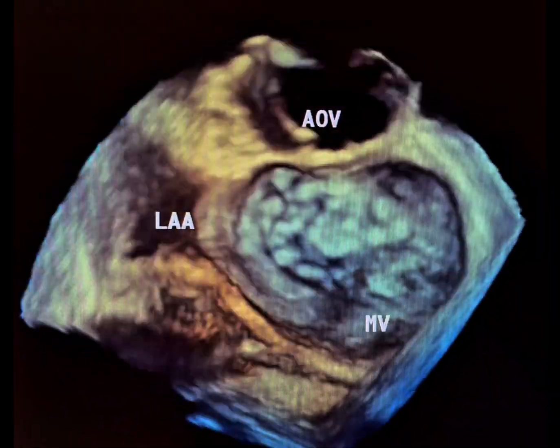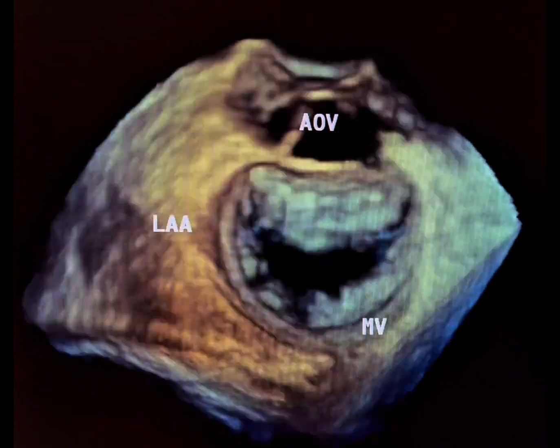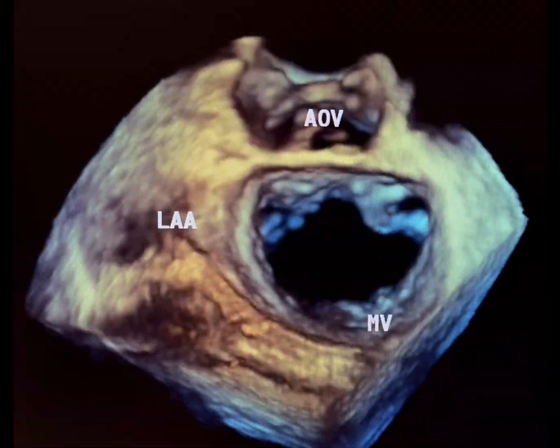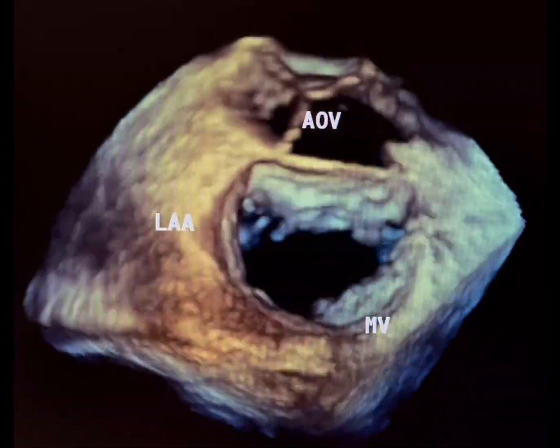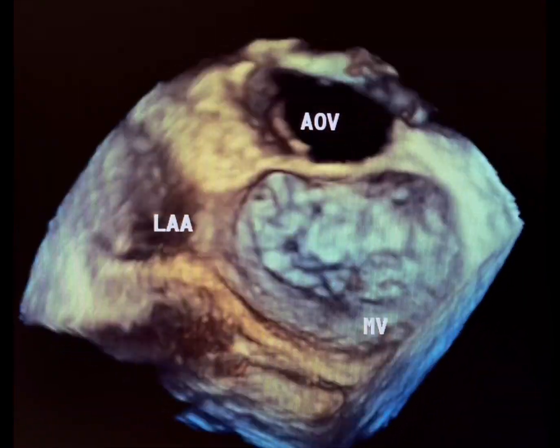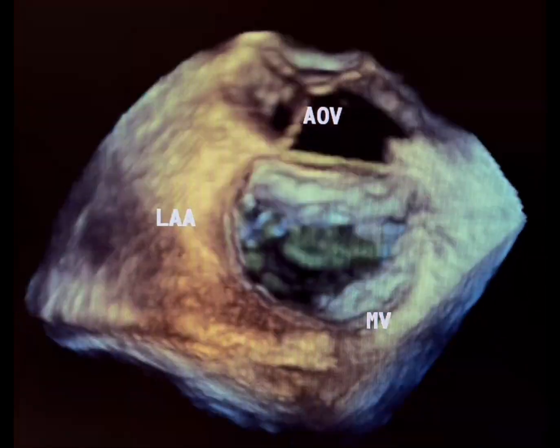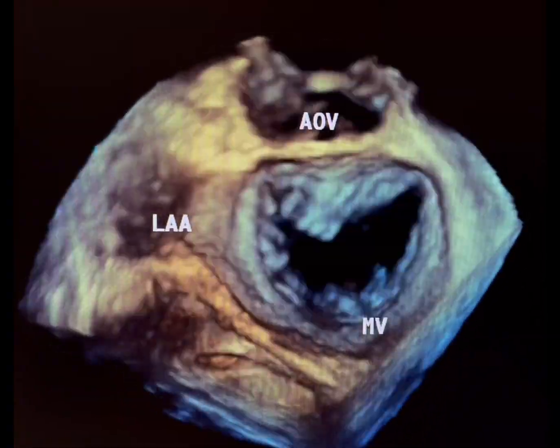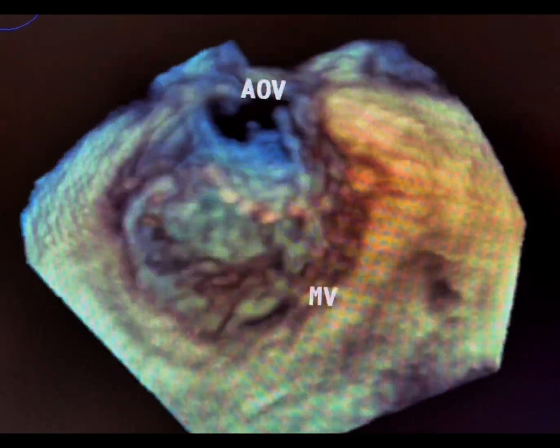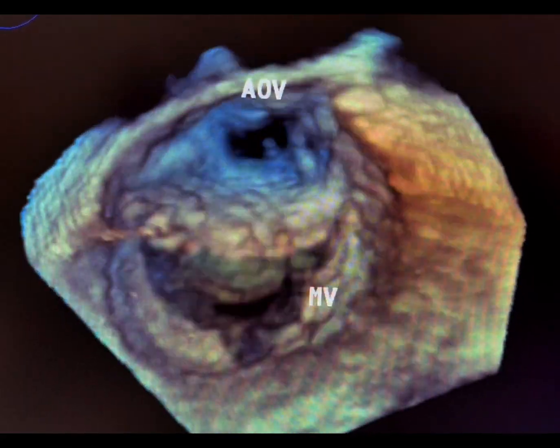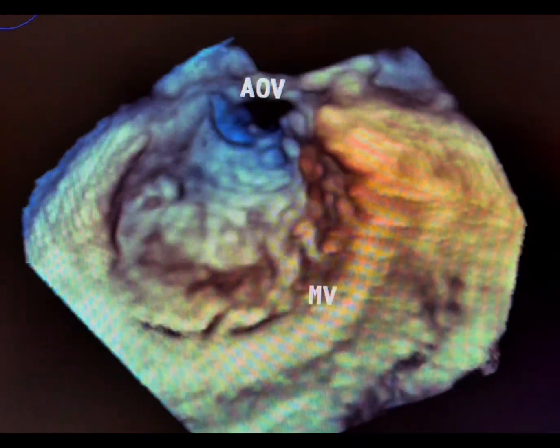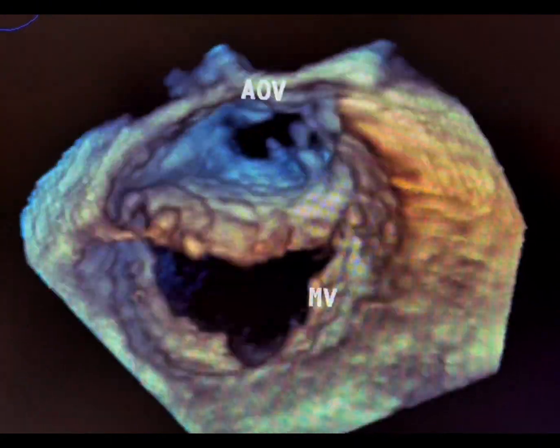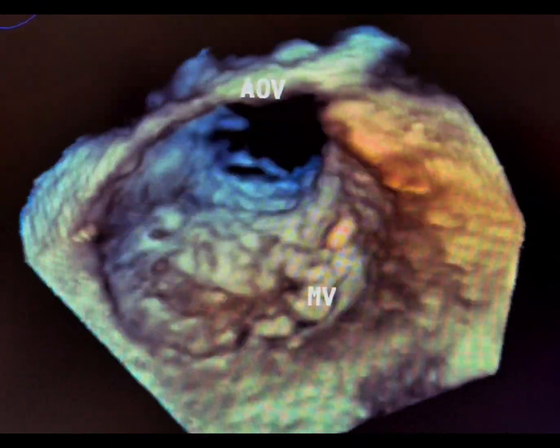In this 3D echocardiogram, we can see the mitral valve leaflets from the left atrial side, normal in appearance. And here we have a view from the left ventricular side, showing normal mitral valve leaflets.